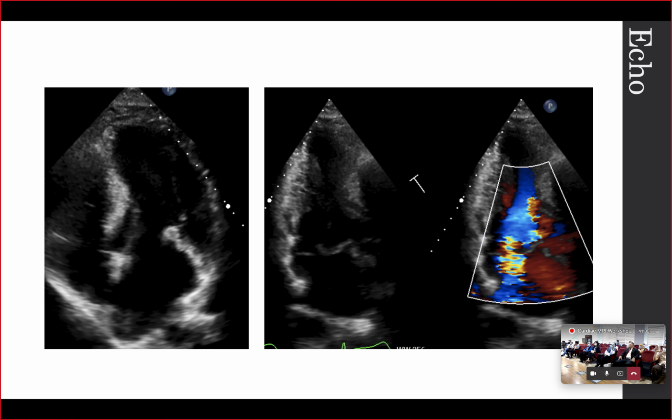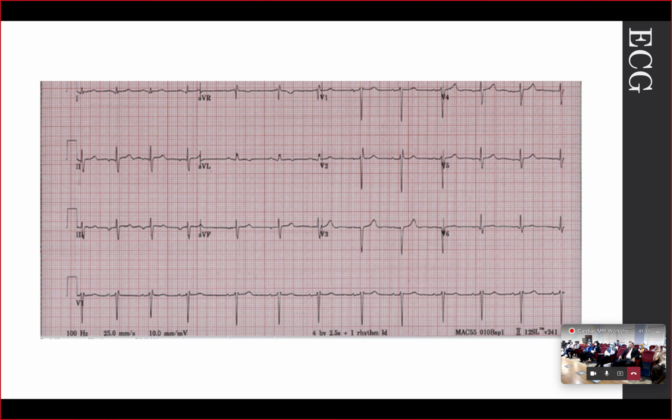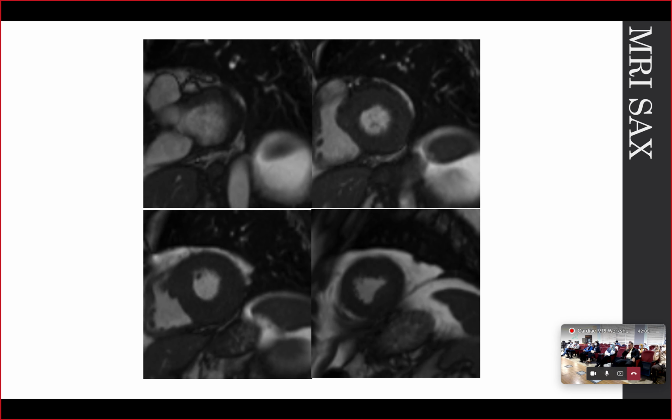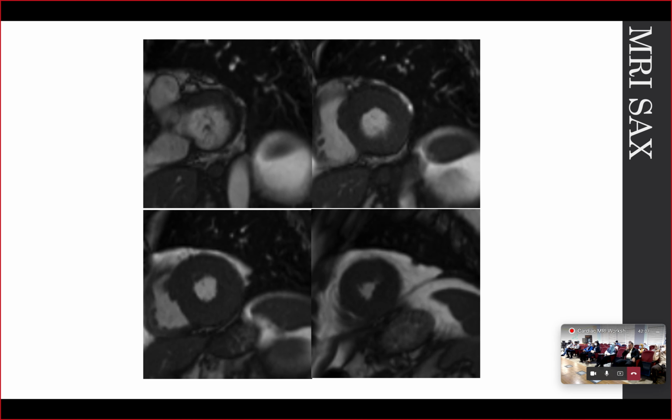And her ECG, as we mentioned, there was no abnormal Q waves, or there was no abnormal QRS, P waves, sinus rhythm. And I think this is the description of the incomplete right bundle branch block. MRI was requested among the investigations that was requested for the patient at that time.